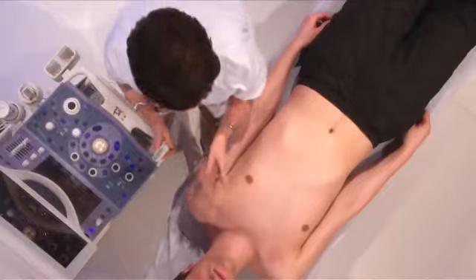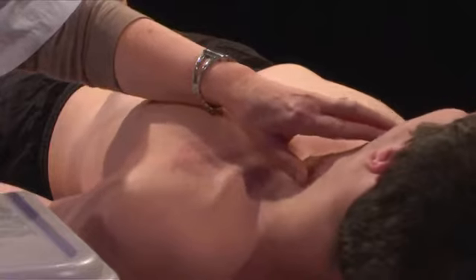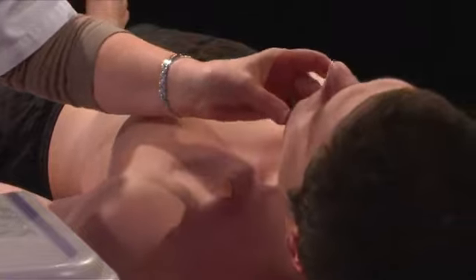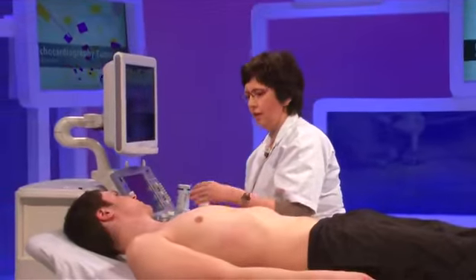I think it's easier to ask your patient to turn his head to the opposite side. And it's easier to always begin with the same side. So it's easier to begin with the right side and then the left side, or if you prefer the opposite.